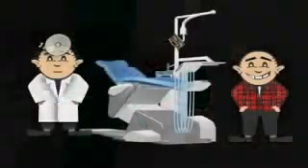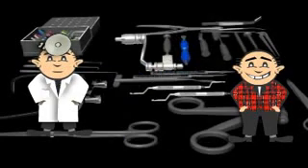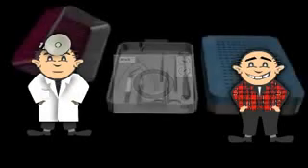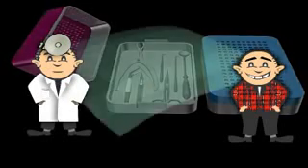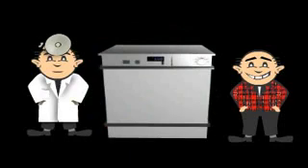How do you find out if you're in good hands with your dentist in terms of hygiene? Ask your doctor about hygiene guidelines. A conscientious doctor will happily answer your questions, while a dentist that has gaps in his system will not be so eager to volunteer information. Ask for sterilization protocols, Class B sterilizers, storage containers, disposable covers, and thermodisinfection device. There will be more about that in the video by the same name.